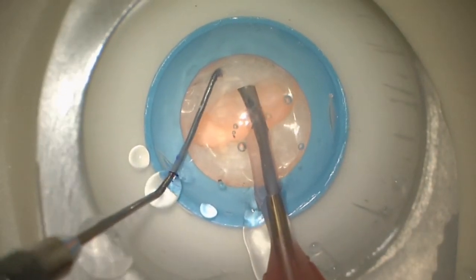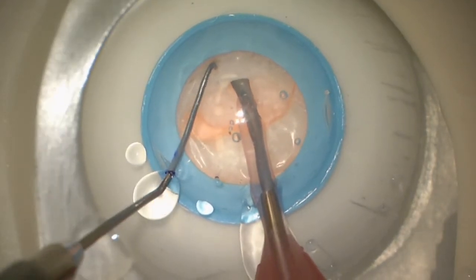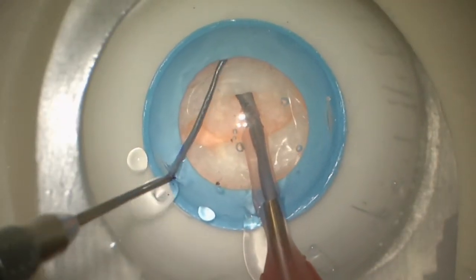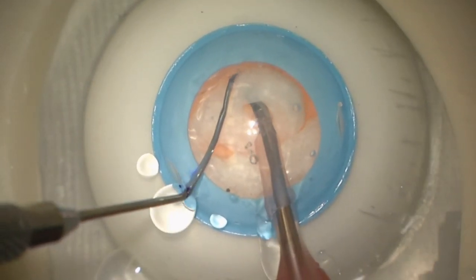Here we're going to embed into the half, using higher vacuum settings now. We'll embed into the half, reach around, and do a very horizontal chop for the stop-and-chop.